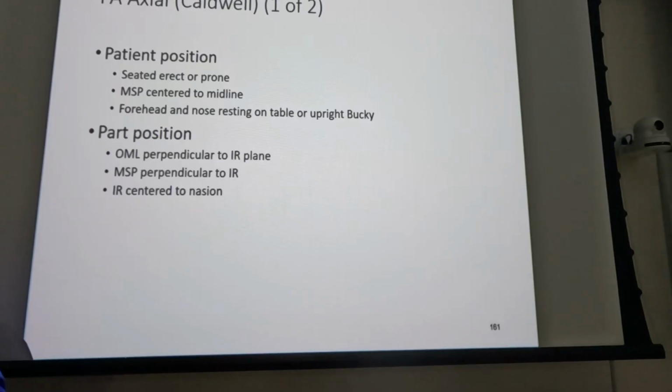Okay. Now you want to shoot this PA. Why do you want to shoot a PA? Yes. Yeah, put the eye closest to the image receptor, increase sharpness of recorded detail. But also, again, you're using the head and the brain as a filter, right? Orbit, radiosensitive, brain, not radiosensitive. You're going to put it closest to the image receptor. You're going to reduce the eye dose.